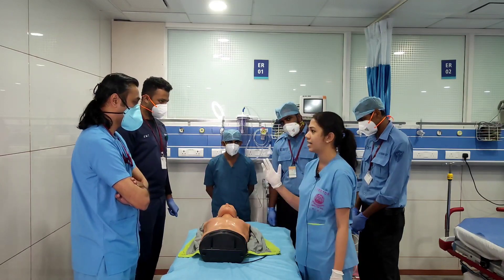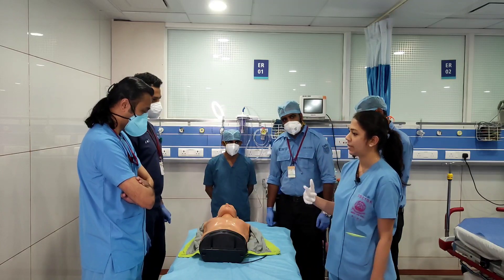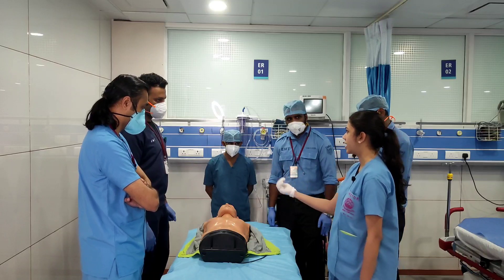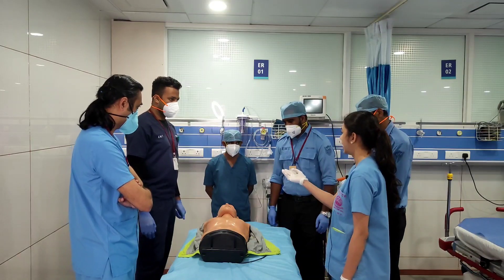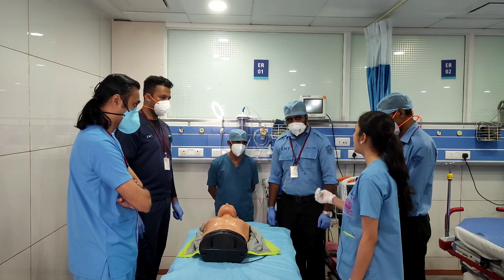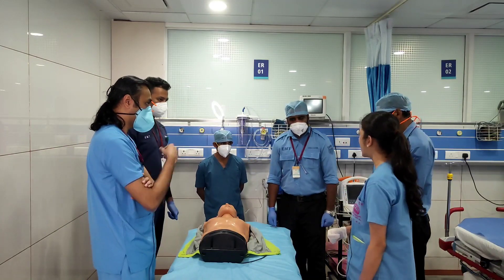I will assign my team. I will arrange one person for chest compressions. You take care of the airway, giving ambo. You connect the cardiac monitors and put in the IV access.